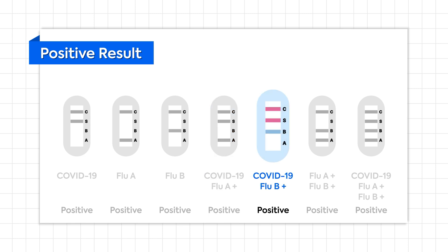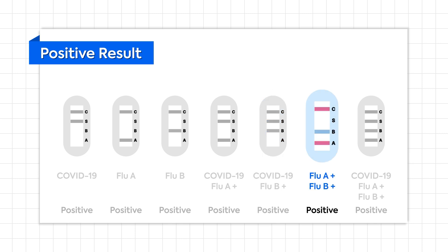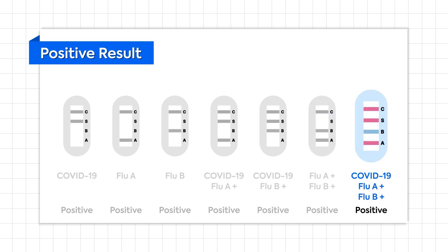If lines appear on C, S, and B, it indicates a positive result for COVID-19 and Flu B — one pink line by C, a second by S, and one blue line by B. If lines are visible on C, B, and A, this implies a positive result for Flu A and Flu B — one pink line by C, one blue line by B, and a second pink line by A. If lines appear on C, S, B, and A, it indicates a positive result for COVID-19, Flu A, and Flu B.